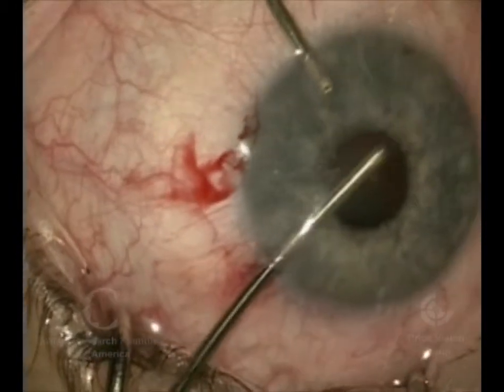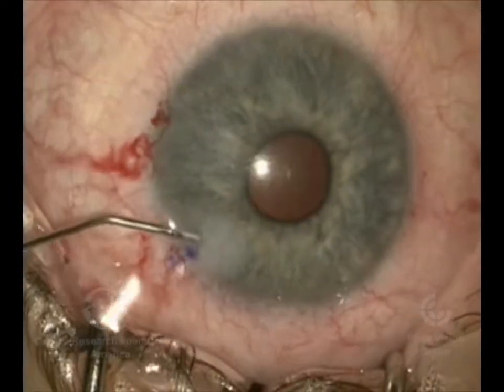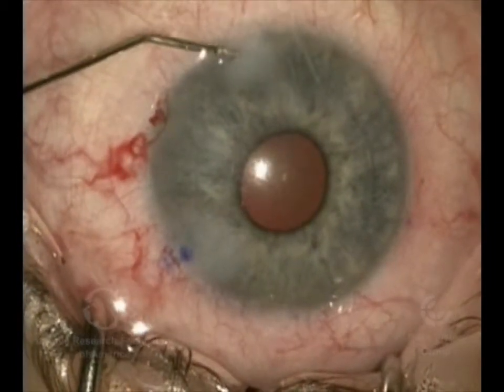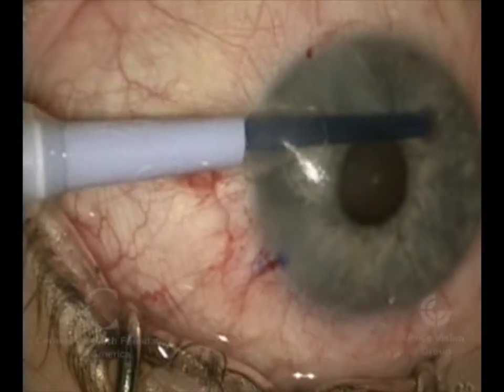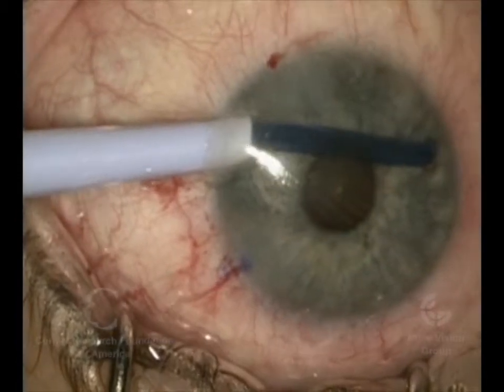So this is really the big difference — the use of viscoelastic for this part — compared to what we typically would do in someone that's already had cataract surgery. We're now going to inject the donor, and the rest of the surgery would go like we've previously shown on our other videos of DMEK.